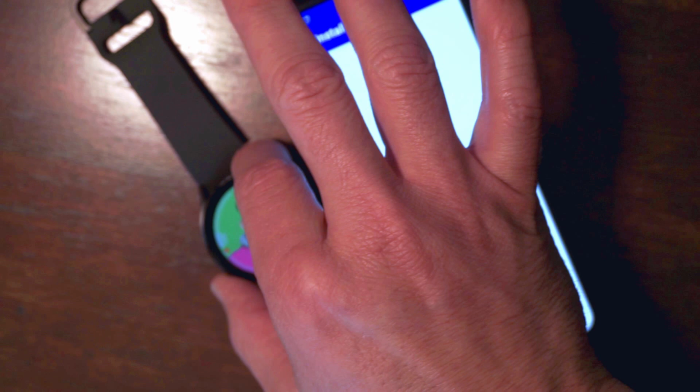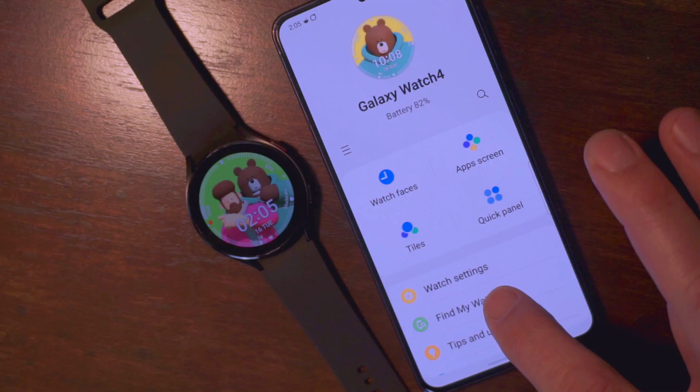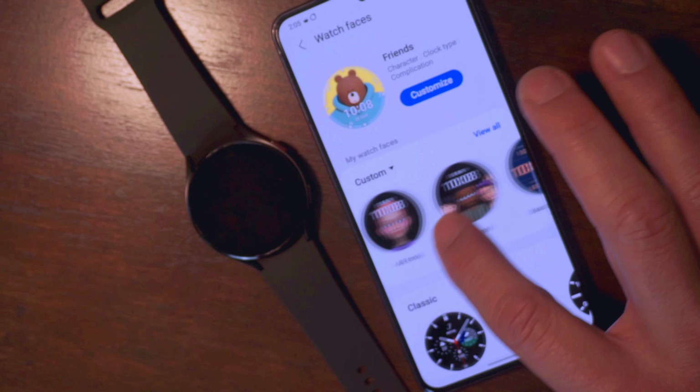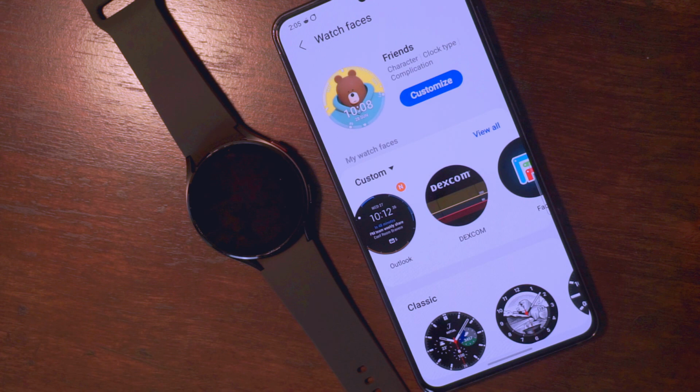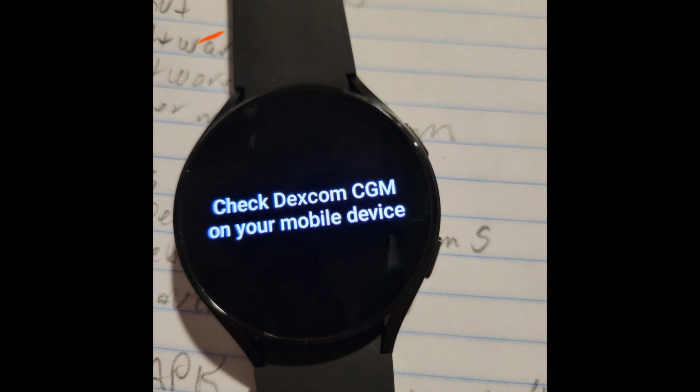Now at this point, I thought I was done and everything was going to work. So I opened up the apps on my Galaxy smartwatch and I couldn't find the Dexcom G6 app anywhere. But I did, however, find the CGM option under Watch Faces. But when I went to use it, it gave me this reading. Which frustrated the heck out of me.